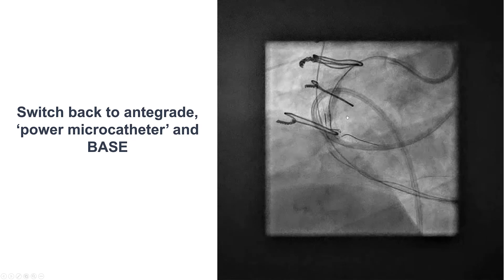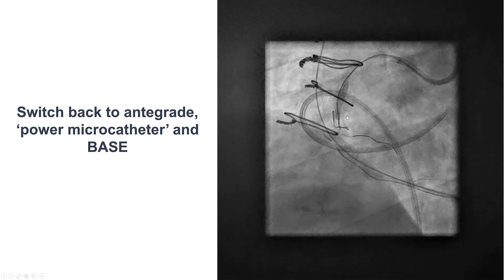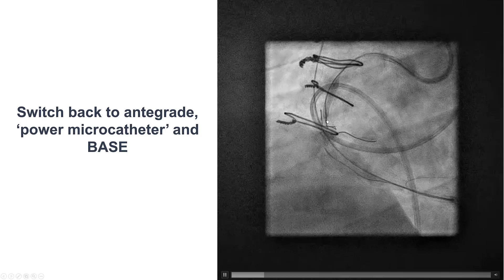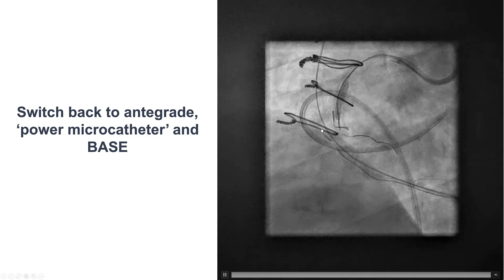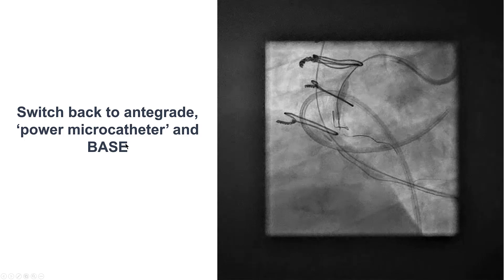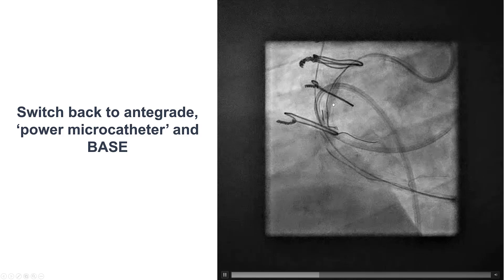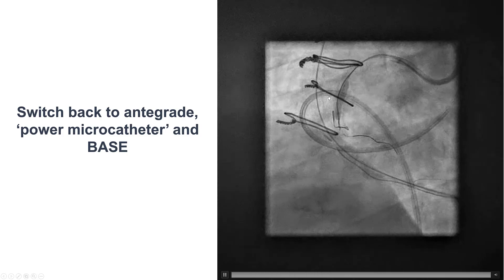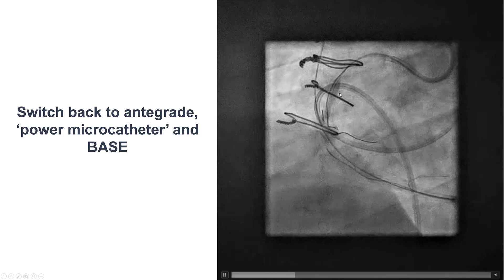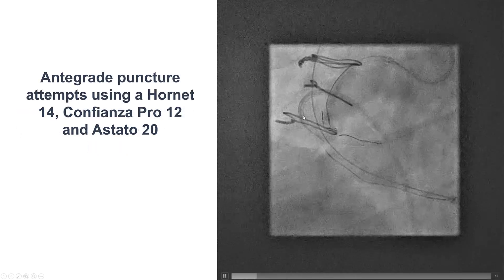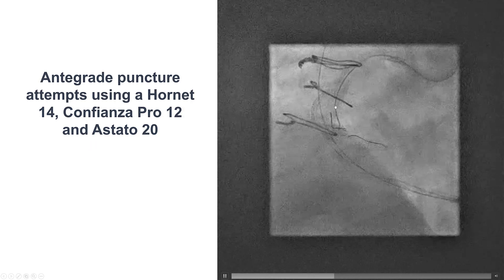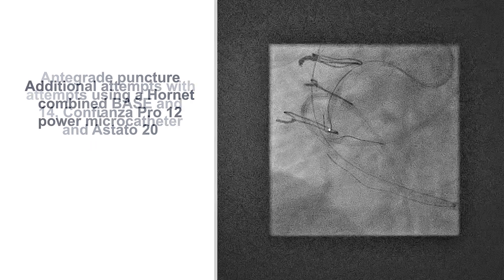We switched again to antegrade attempts because we were unable to further advance the retrograde guide wire, which was in the extraplaque space. We were unable to advance wires, so we decided to perform the BASE technique — balloon-assisted subintimal entry — using a large balloon to create a dissection into the wall of the right coronary artery and then tried to get an antegrade wire into the extraplaque space. Despite using multiple guide wires, we were unsuccessful in achieving that.